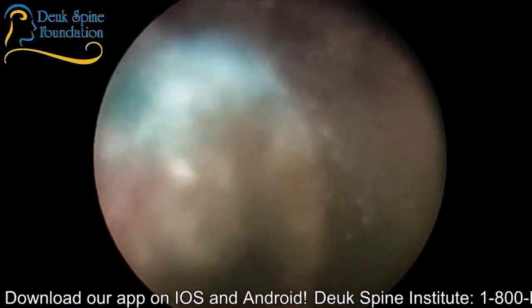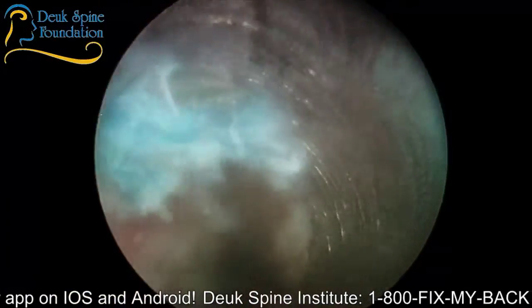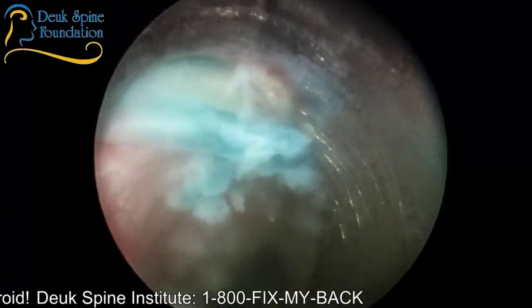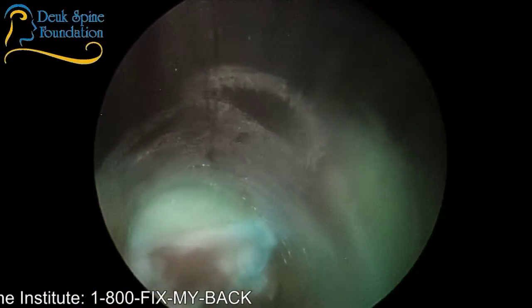All right, that's the disc tear. Let me just check, let me just verify. Yeah, that's the epidural space up there. You see the fat, the golden fat, and a little bit of epidural veins. And the nerve, the left L5 nerve root will be right there.